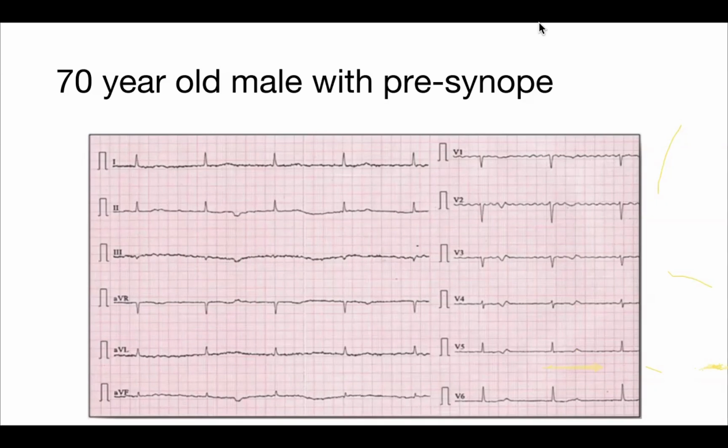There's a very big misunderstanding about flutter waves and the flutter fibrillation diagnosis. Remember, there's no entity called flutter fibrillation.